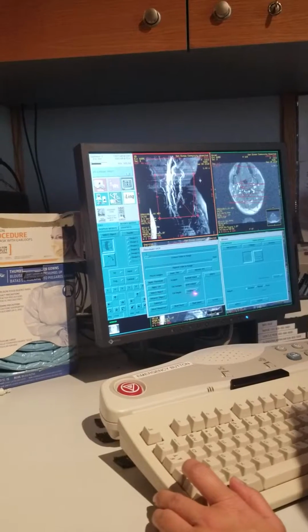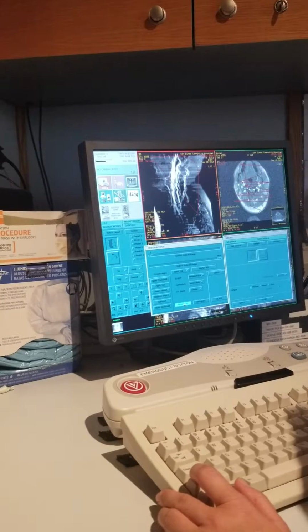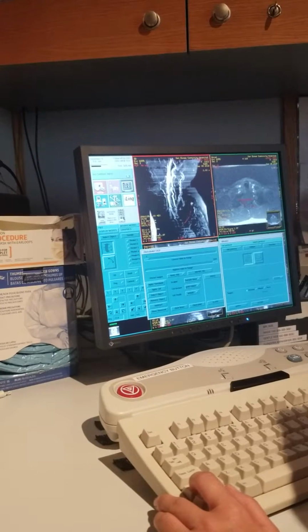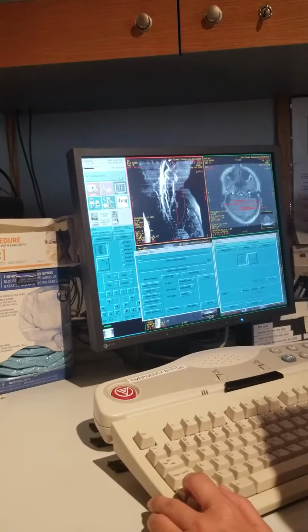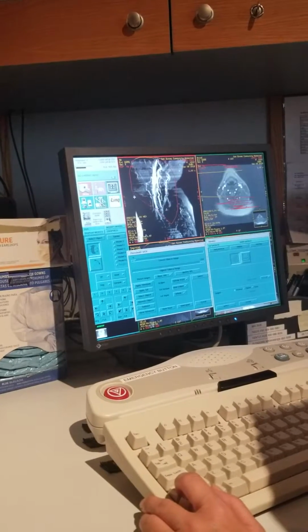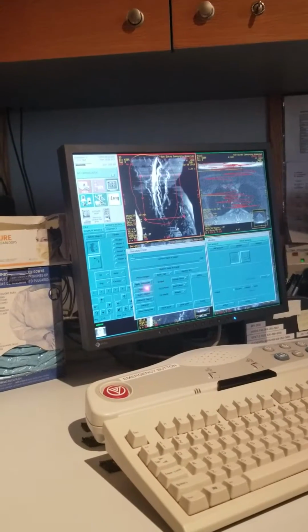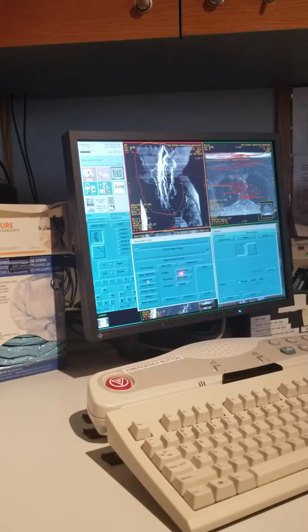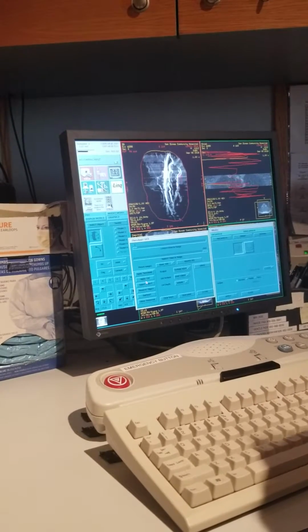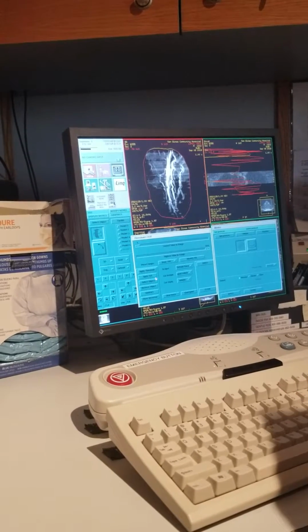Now let it go. Now you're going to clear that trace right here, and you're going to start over. So start from down here. That's it. Okay, good. You're going to apply the cut, which is going to clear everything outside of the trace. If you wanted to clear inside, you would have to change this to the inside. So now you're going to hit clear trace.